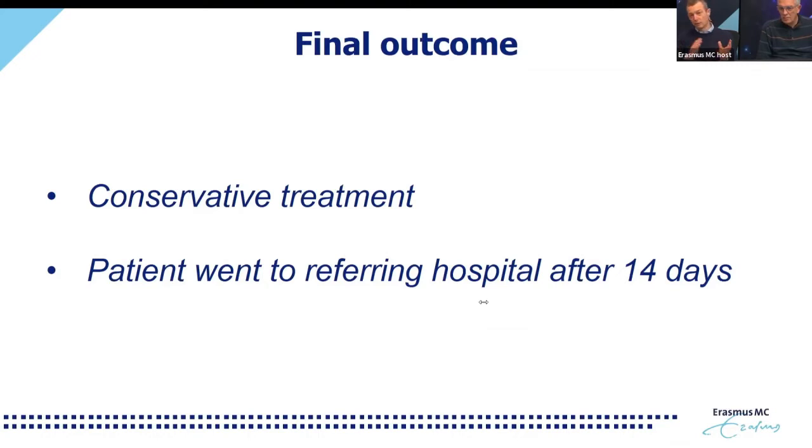Conversely, if you have a hematoma that is severely luminal compromising and the patient has active ischemia, you need to do something. And there, I think there is always a balance, depending on the type of dissection, between either putting a very short stent to just cover the ostial tear causing the hematoma, or using a cutting or scoring balloon to dislodge the blood in order to restore the flow. Because at the end, the best antithrombotic tool will be flow by itself, in combination with antiplatelet and antithrombotic agents.